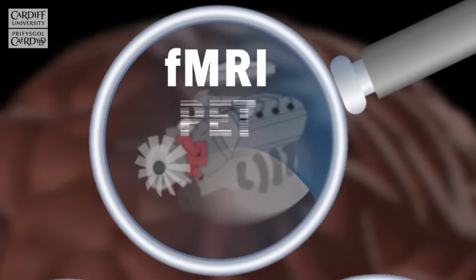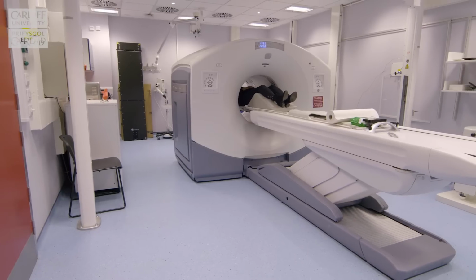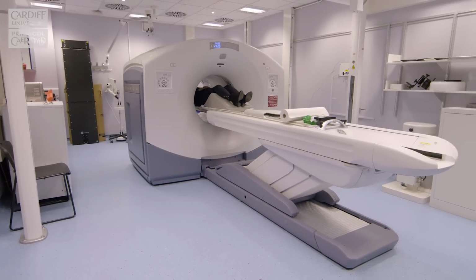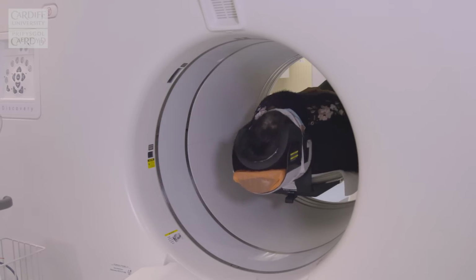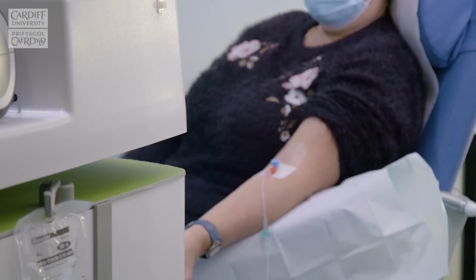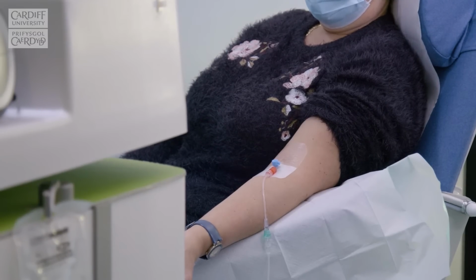PET, positron emission tomography, shares some similarities with fMRI in that it provides information about the function of the brain. Unlike fMRI, PET requires an injection of radiation that tags onto different biological properties and can give far more biologically specific information than fMRI.